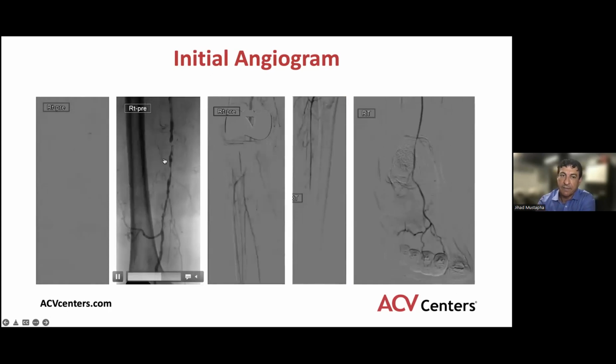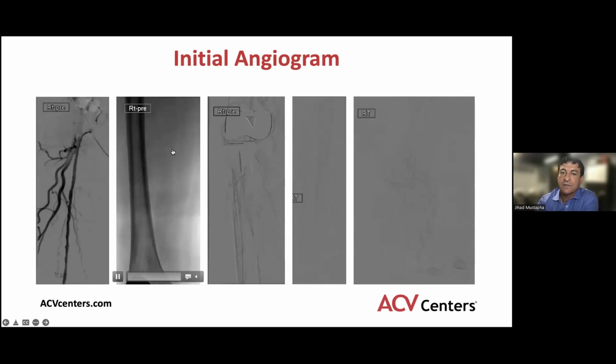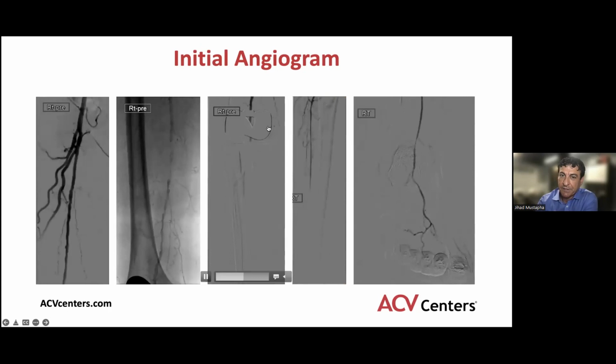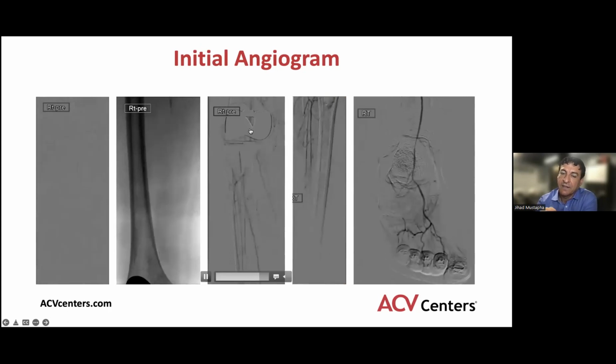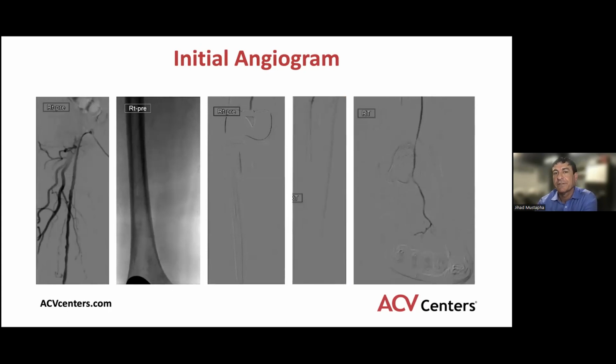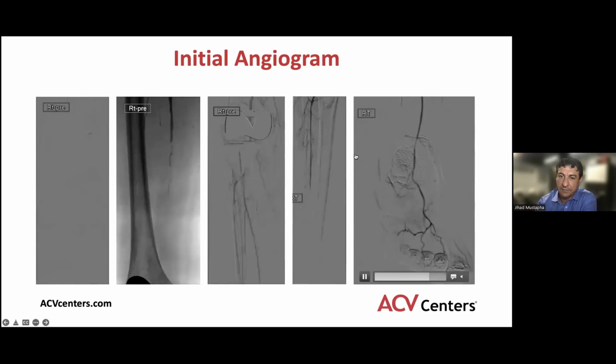Never undermine a calcific lesion that appears to have some flow in it. And as we go into the popliteal, especially when there's a knee replacement, this is something that you have to look into carefully to make sure that you don't miss anything behind the knee.